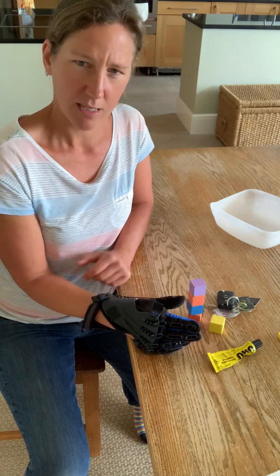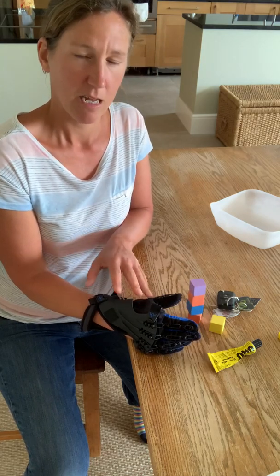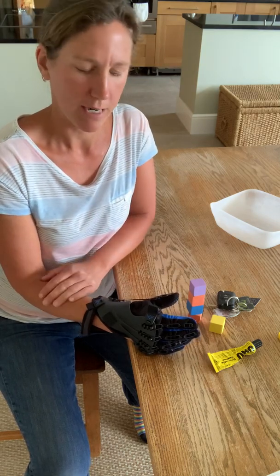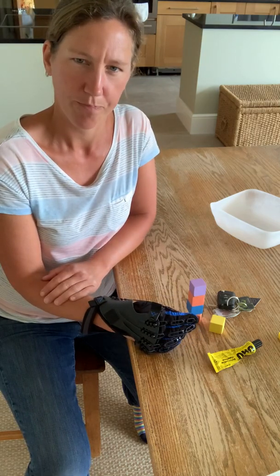I'm doing it in sitting so that I can really focus on my hand. If you want to challenge yourself more, stand up and do it in standing so that your balance is challenged a little bit as well.